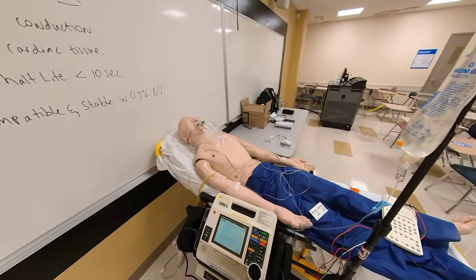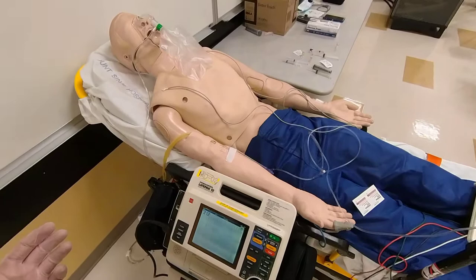Hello, my name is Nikolai Yusupov, and in this video I'd like to show you proper adenosine administration. So first of all, we have a patient who is showing supraventricular tachycardia as you see on the monitor.